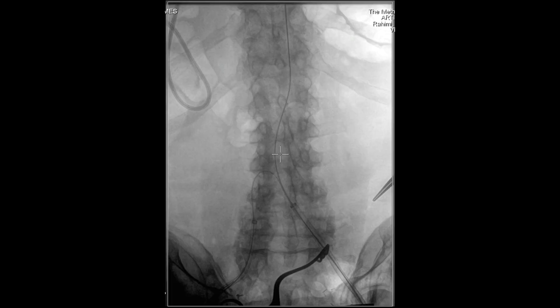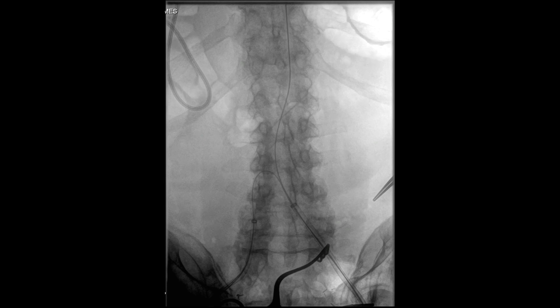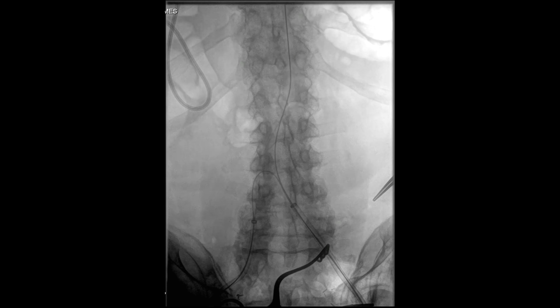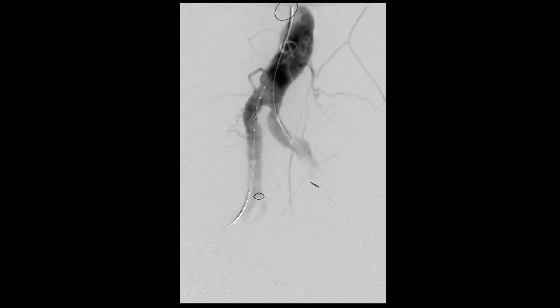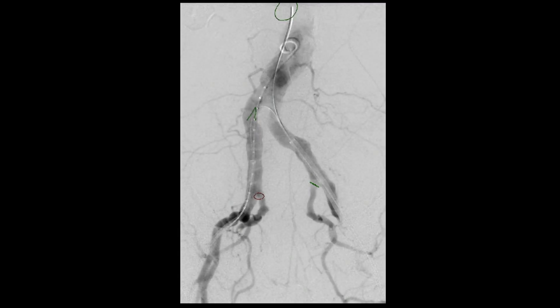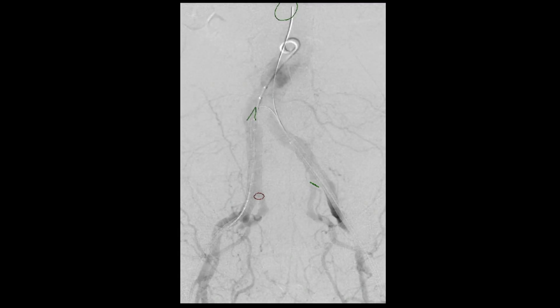Next, a pigtail catheter is introduced in the abdominal aorta. An abdominal aortogram and pelvic angiogram is then performed to better delineate anatomy.